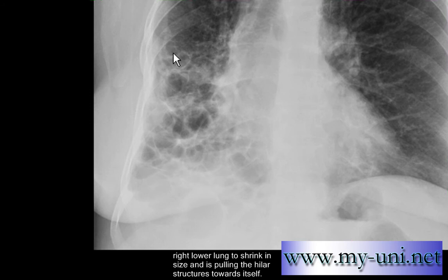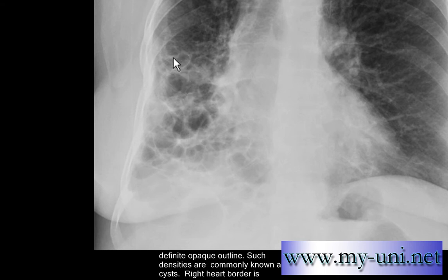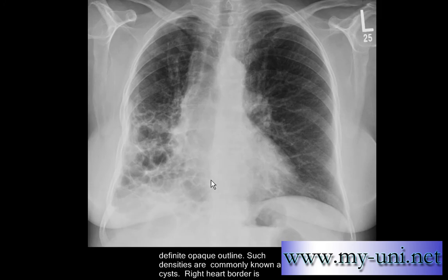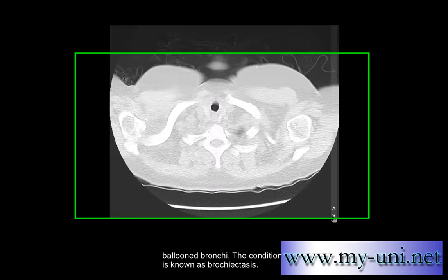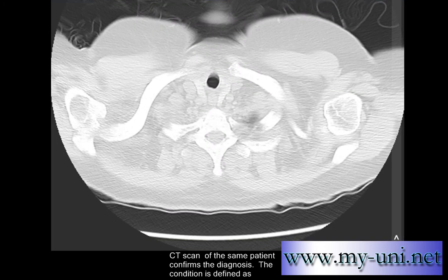Multiple round hazy densities of varying sizes are present, nearly all of them with a definite opaque outline. Such densities are commonly known as cysts. The right heart border is not visible — this is known as loss of silhouette sign. The cysts are nothing but dilated and ballooned bronchi.